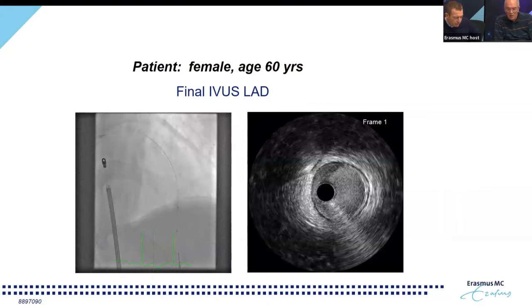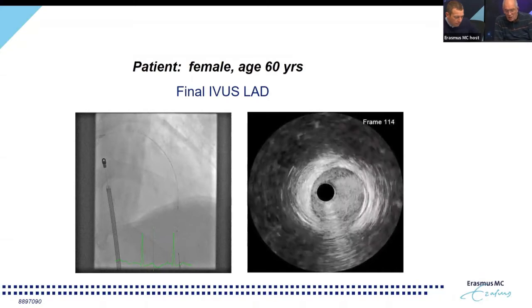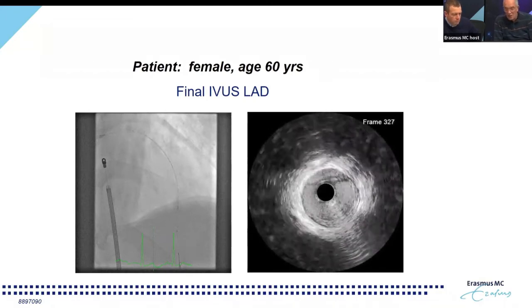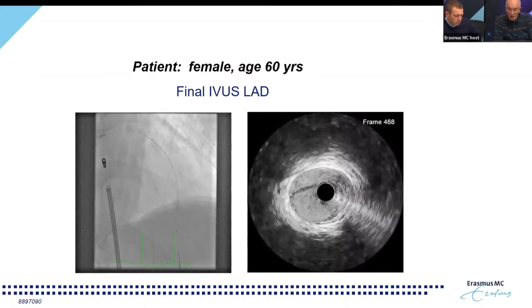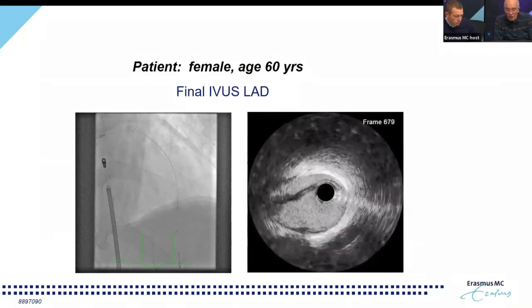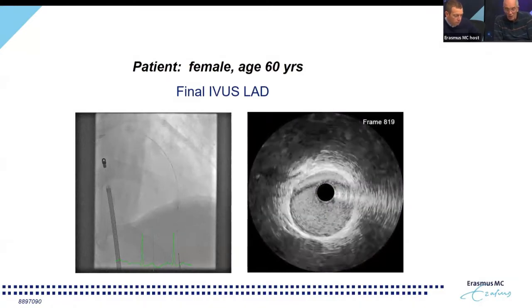that we still have a little bit of hematoma. That's not surprising, but you see that the lumen is not that compromised anymore, and it definitely will not fill further. At the end, this will get away. So we're still distal from the stent, and actually we have a normal vessel. There's no plaque in there. We only see the hematoma.